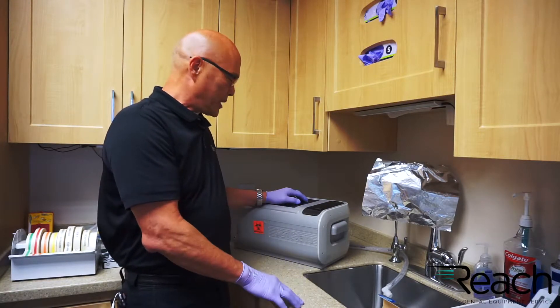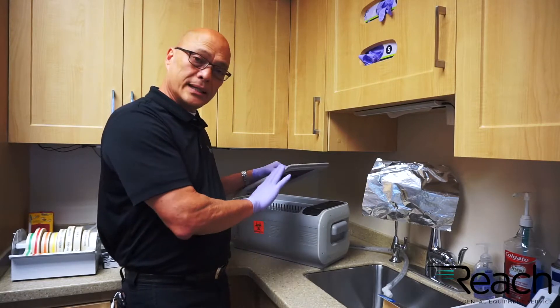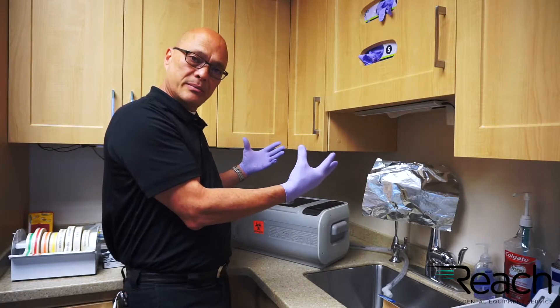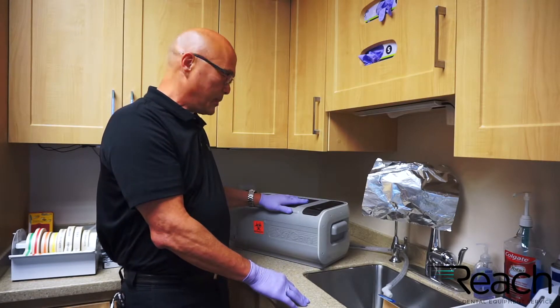One thing you want to make sure when you're using an ultrasonic cleaner is never operate it without a lid in place. When they are running they create a lot of aerosols that can be bad for you. So always use it with a lid in place.